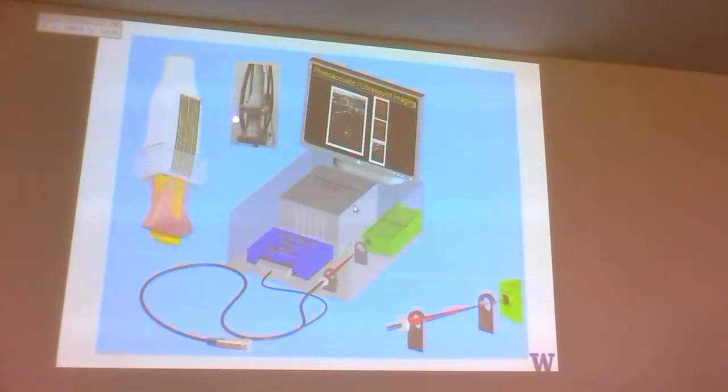And this up here is actually a photo of the thing, so it's a Rube Goldberg type of thing. That's a traditional ultrasound array transducer of the last generation, and you just bring in a bunch of fibers. Those fibers are all in parallel, so they will be fired. You have a low repetition rate, high intensity laser, which drives all these in parallel.